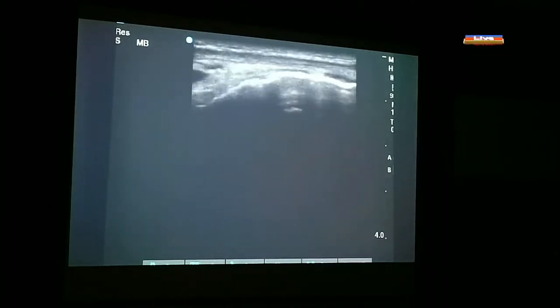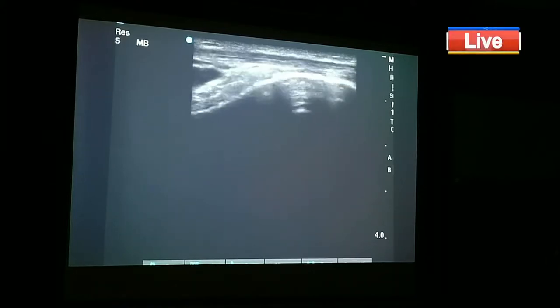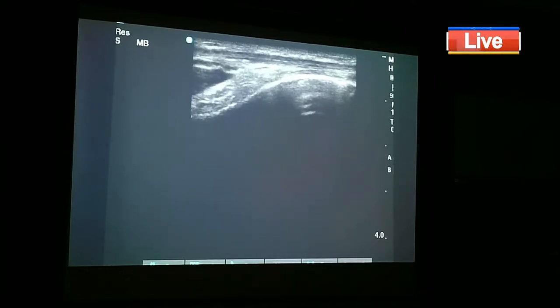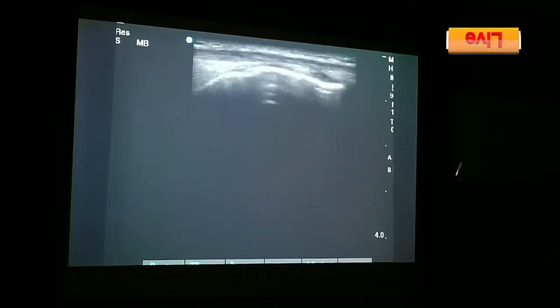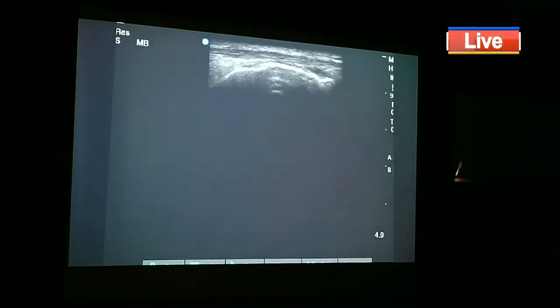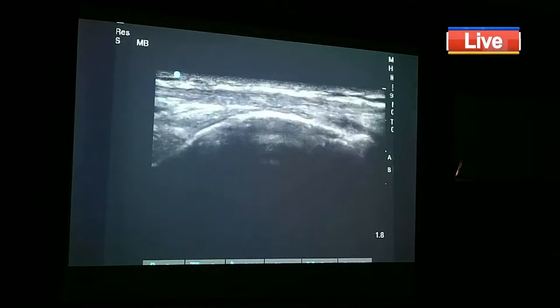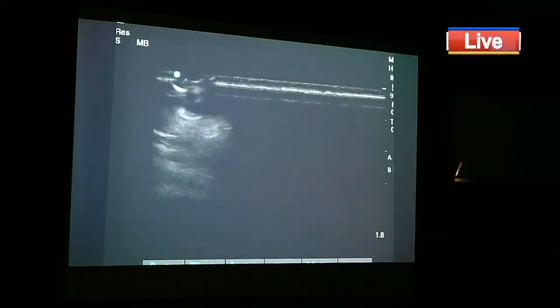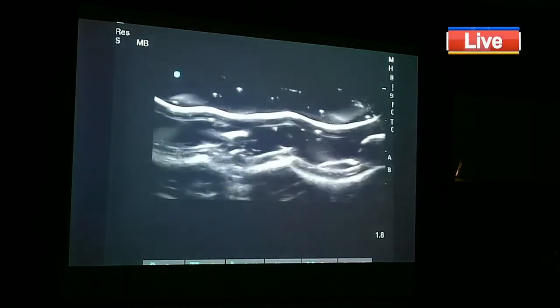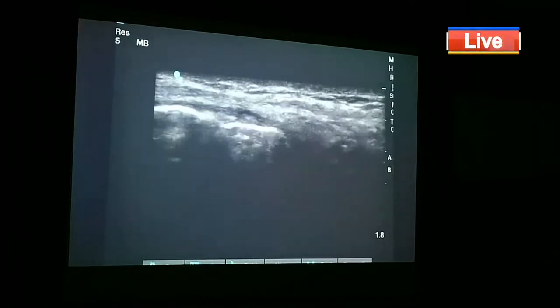Now in the lateral compartment, I'm going to see whether my meniscus is at the correct spot, and also I'm going to see the condition of the ligament, which is the collateral ligament, okay? And all these I can very nicely visualize, so I will decrease the depth, and I will try to make it much better for you all to appreciate. Is it visible behind everybody? Yes. Now I'm going to put in some jelly here, and then I'm going to see. So I'm covering him all around with jelly.